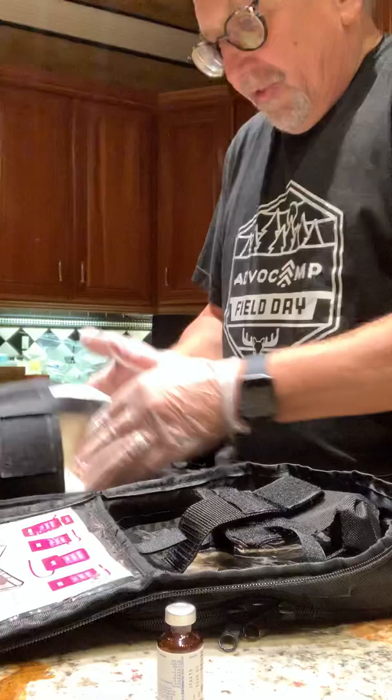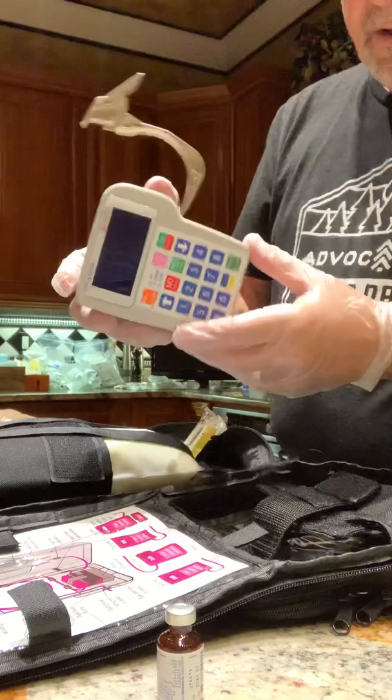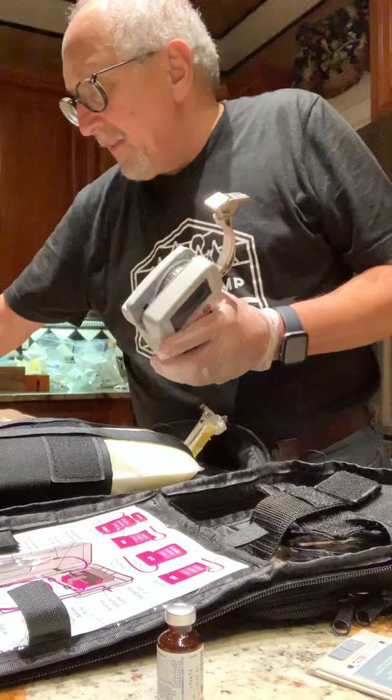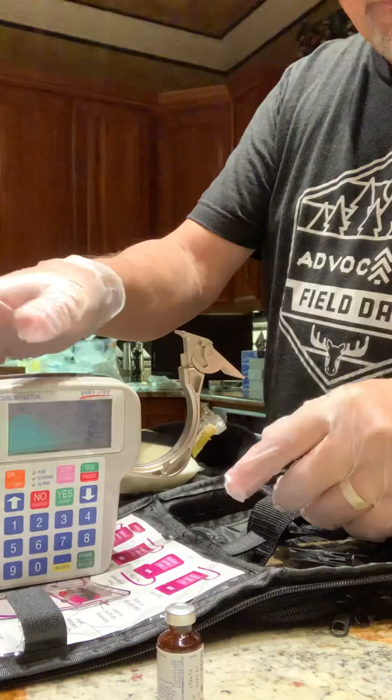The next step is the easy one — like they say, shaken not stirred — so we shake the bag, almost like kneading dough. Now, this is the pump, which contains the program that dispenses the formula. There are two batteries in the back; a TPN run takes about half the power of a battery, so we always insert a new pair of batteries into the pump, close the battery door, and lock it.